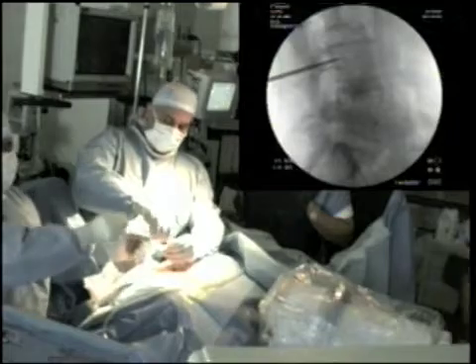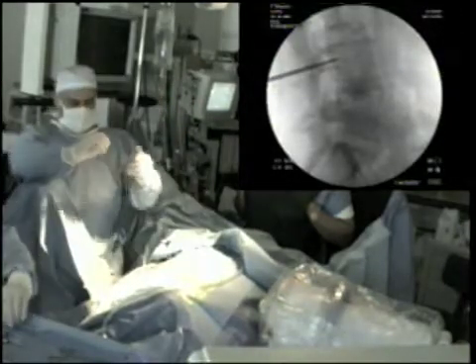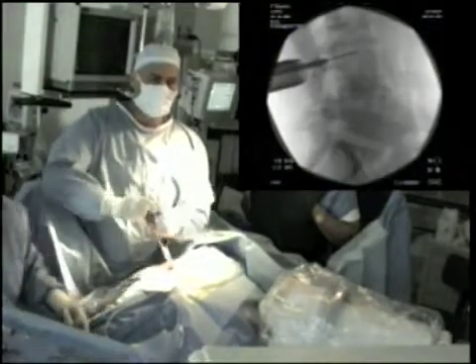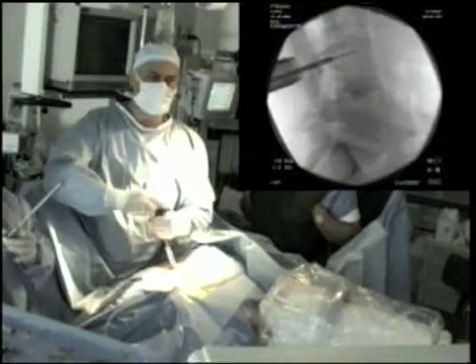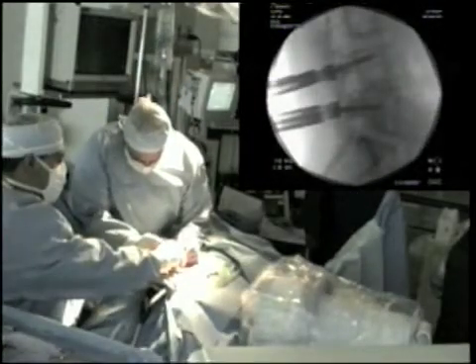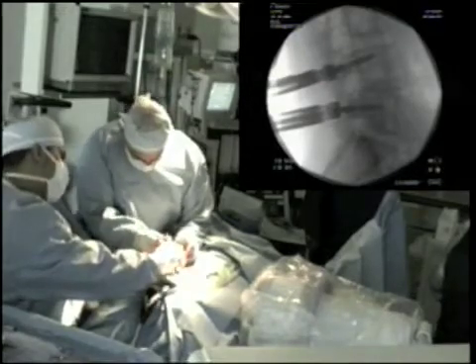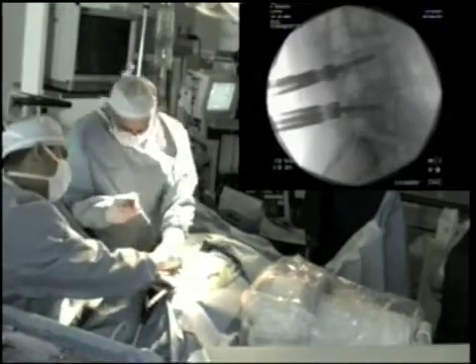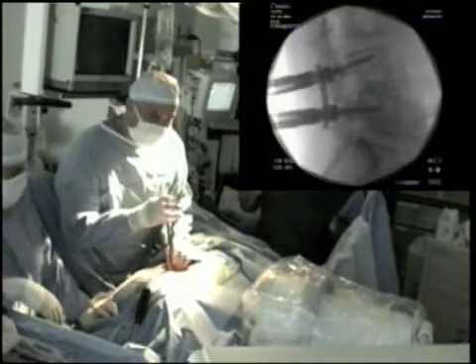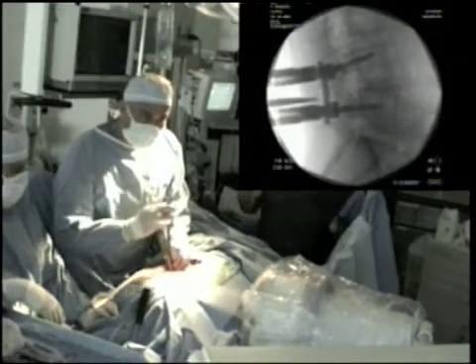Once the intervertebral mesh cage has been inserted, pedicle screws are placed through the pedicles, in this case at the L4 and L5 levels. A percutaneous K-wire guided system is used for insertion of cannulated pedicle screws. Fluoroscopic guidance is again critical in optimising the position of the screws.